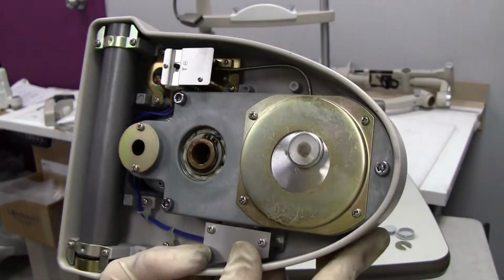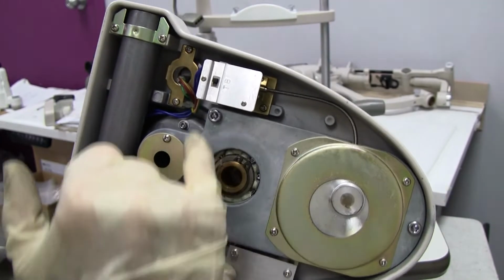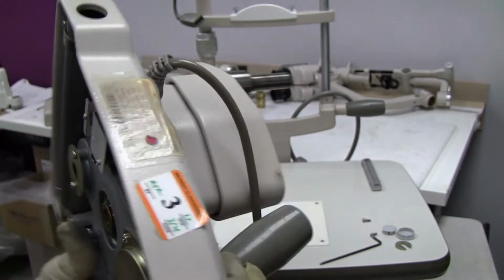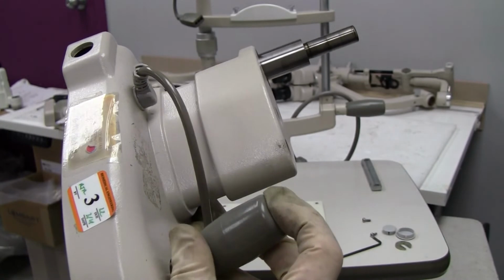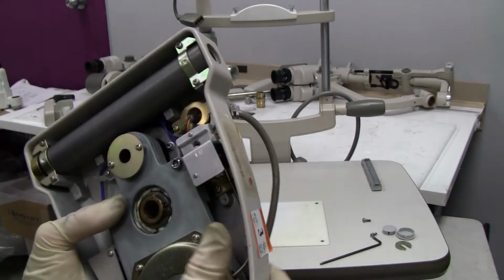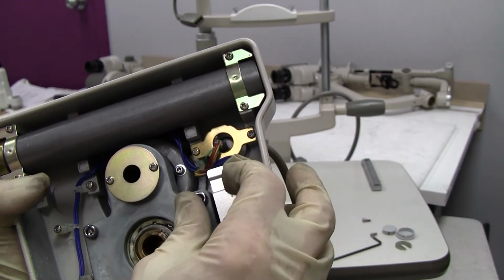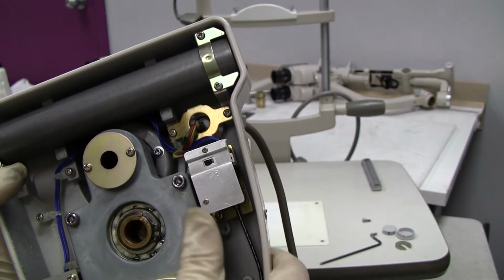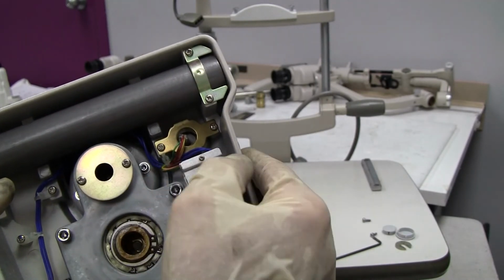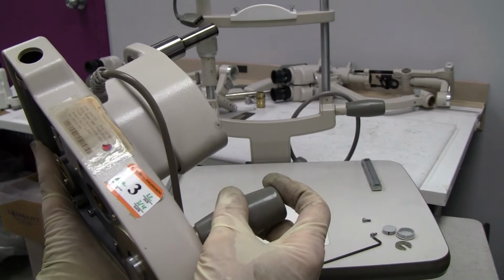So underneath here, you've got three Allens. These are 4 millimeter, but you're going to have to take off this plate. Your switch, where your button on your joystick operates this switch, which is an override. When it's on B, it's an override for the base. When it's on T, I think that has to do with the tower if you have some kind of photo attachment on it. But normally it's just going to be on B for base to override your light to get the brightest light when you want it.